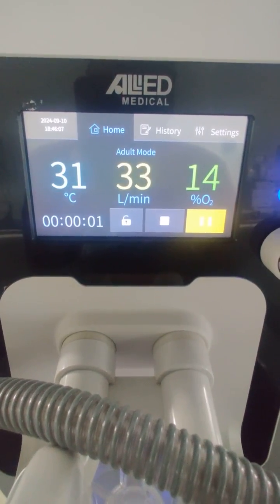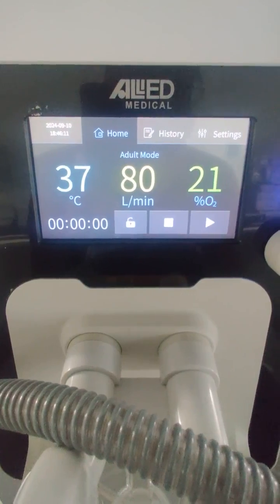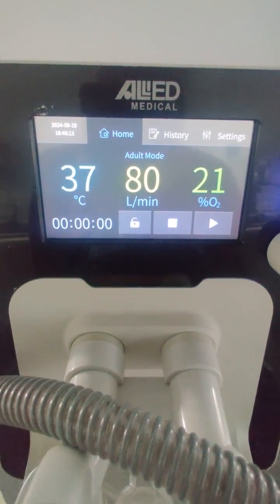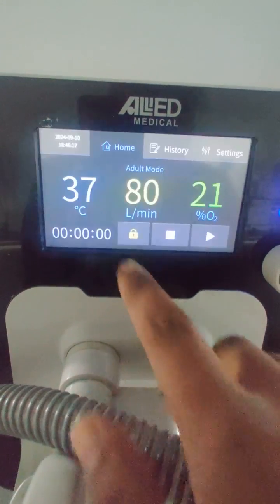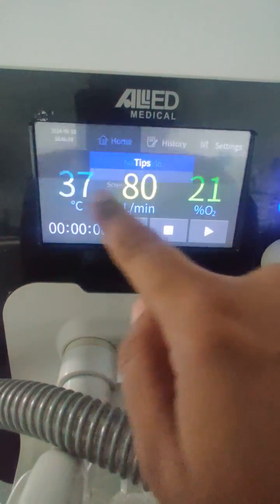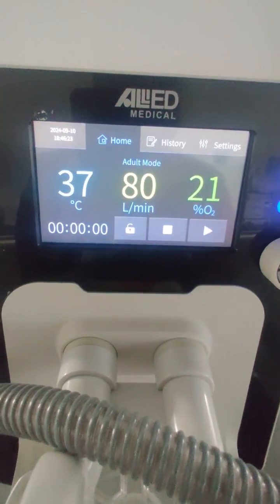To start the therapy, press the play option and flow will begin generating. To stop the therapy, press the stop button. There is also a screen lock option to lock the touchscreen so nothing can be accidentally changed; press unlock to reverse this.